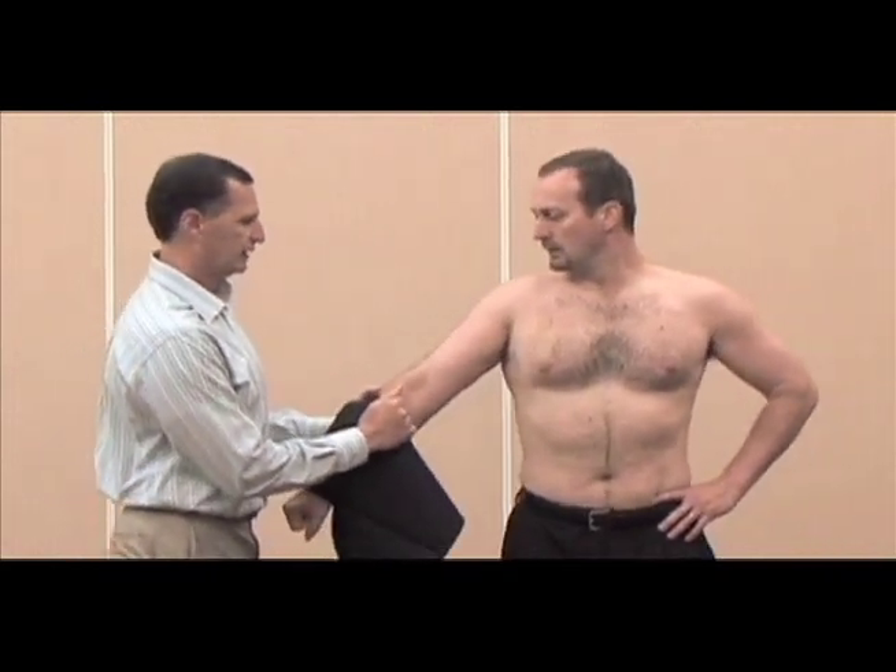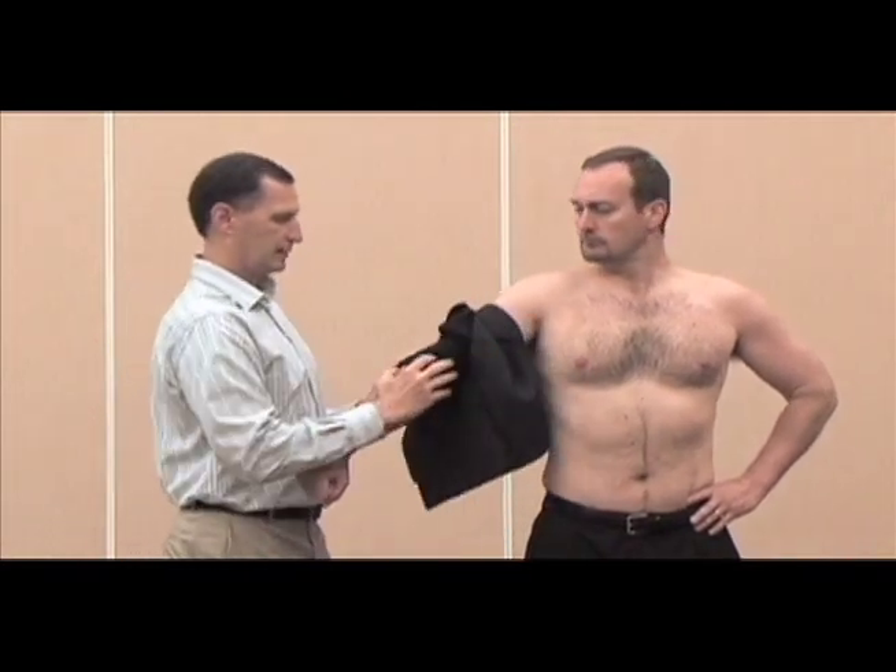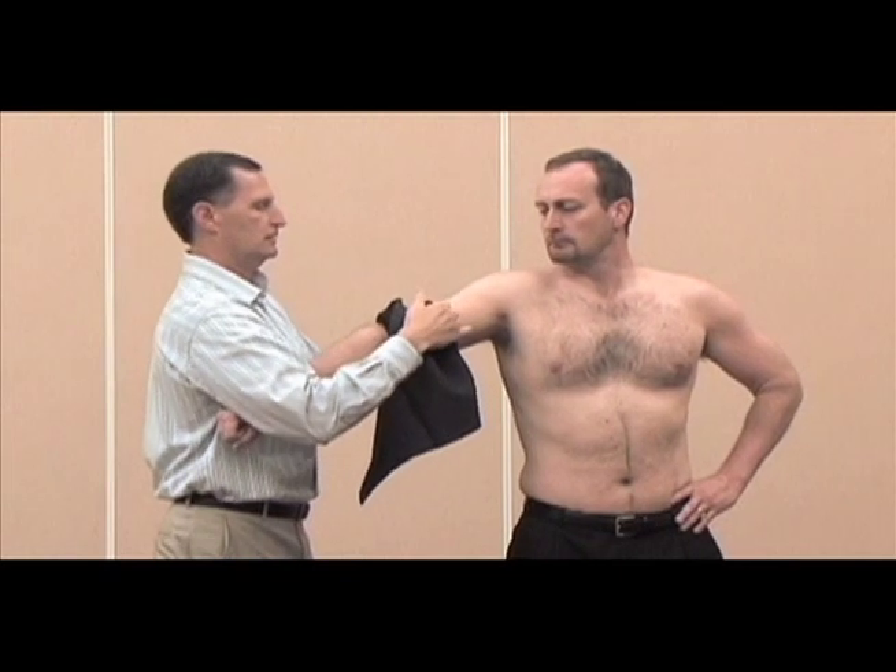It's really essential to get the body of the Soli applied right, ideally right next to the skin — it makes it a little bit easier. Roll the top of the sleeve back and start sliding it up the arm. If you run into a situation where it's really tacky, sprinkle a little baby powder to make it slide up the arm a little bit easier. A little trick is to take the bottom of the sleeve, roll it up towards the top, and have the athlete push down into the Soli.